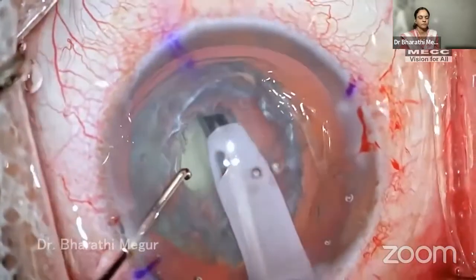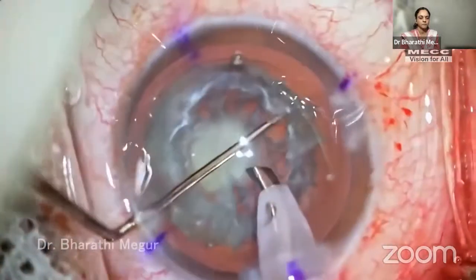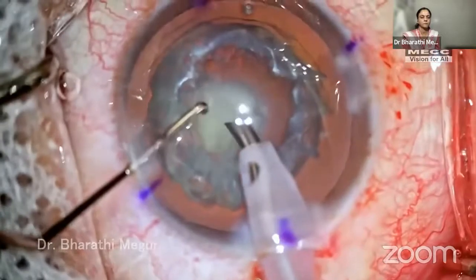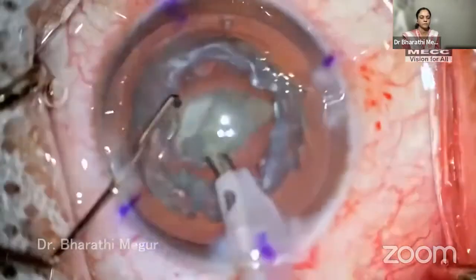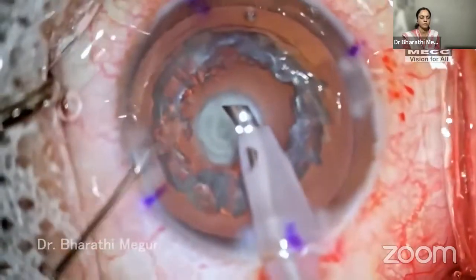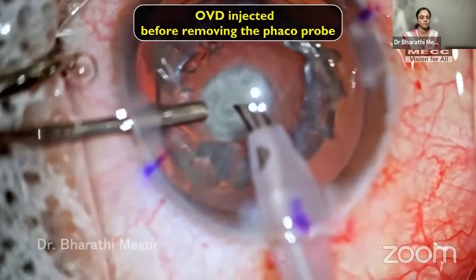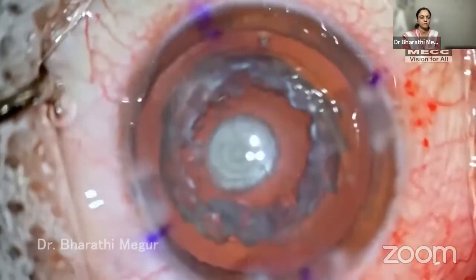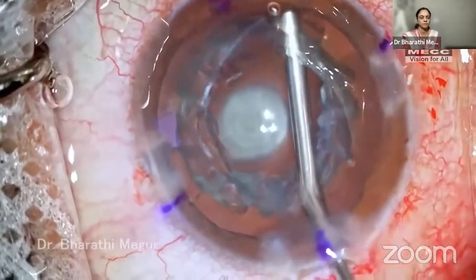Careful inside-out hydro-delineation is done. As expected, the nucleus is soft. A central groove is made. I am using the second instrument to cheese out the lens material. It is coming in bits and pieces. The soft endonucleus is eventually consumed. Before removing the handpiece, OVD is injected into the anterior chamber to prevent it from shallowing as the phacoprobe is removed.